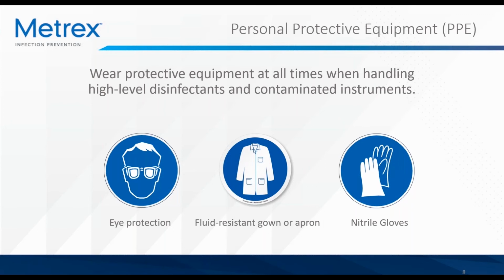You should wear eye protection to protect your eyes from splash and splatter that may occur when you're immersing or removing instruments from the solution. Metricide OPA Plus is a liquid solution, so you'll want to wear a fluid-resistant gown or apron. Nitrile gloves should be worn as well, especially if you're immersing instruments into the solution. You want to make sure the chemical isn't coming into contact with your hands.